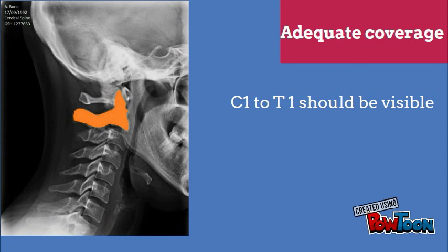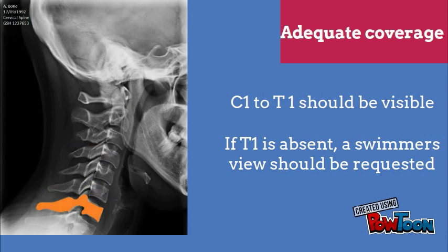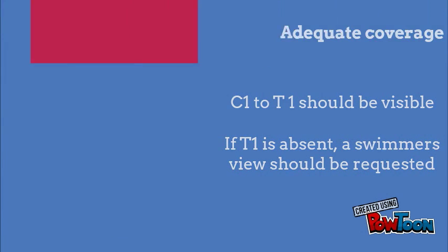Adequate coverage. Ensure that all vertebrae from the skull till T1 are visible. If T1 is absent, a swimmer's view should be requested.